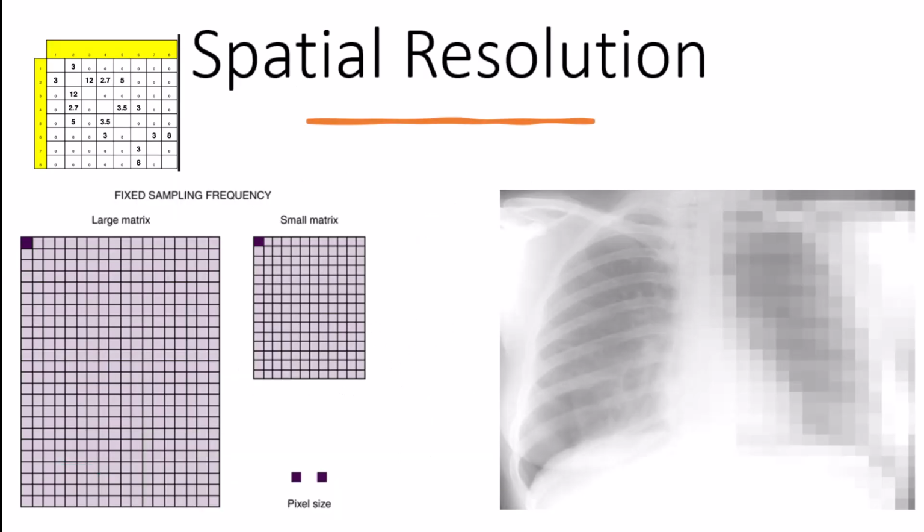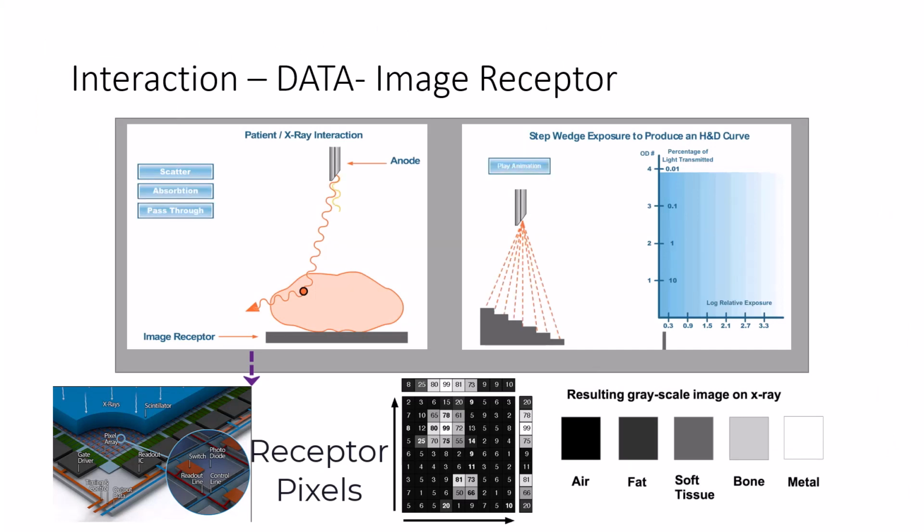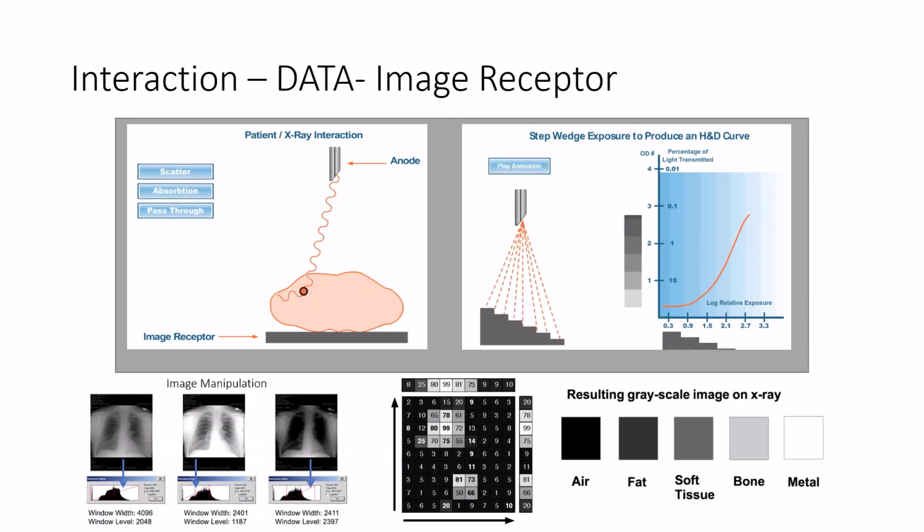The computer creates the image almost like a paint by number, and the number of pixels you have determines the spatial resolution. Each picture element in the active matrix array can only have one color or one shade of gray. The computer uses an algorithm or histogram to display the image selected.